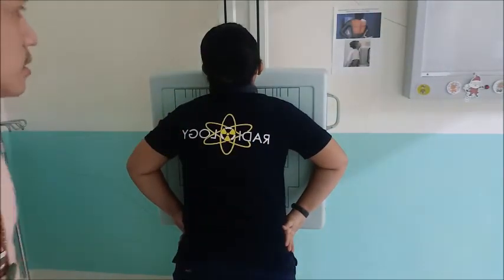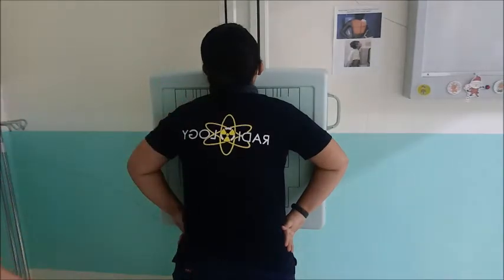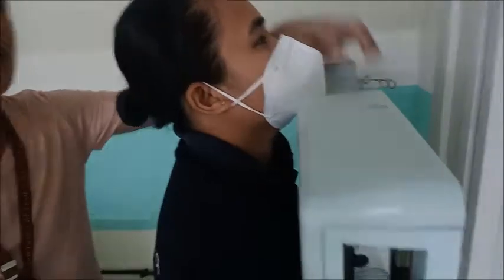So again, you have the button here. You can raise it, you can lower it.